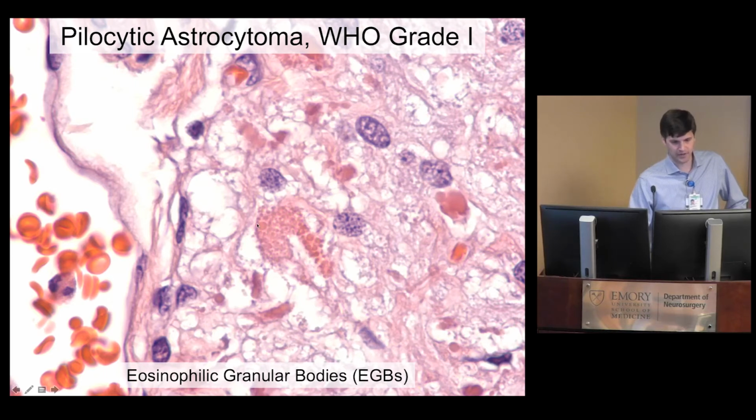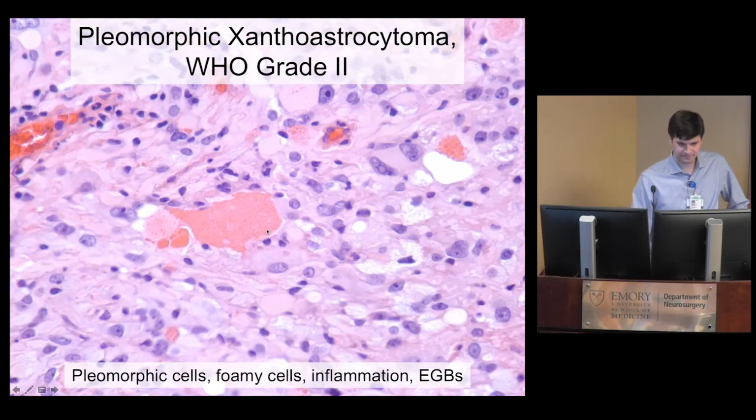These are proteinaceous, rounded concretions, and they're usually seen in high density grouped together. They're pretty small. You'll see a bunch of them grouped together, and that'll draw your eye. These are red blood cells over here, so that's 5 to 6 microns across, and they're looking pretty big in comparison to our EGBs.